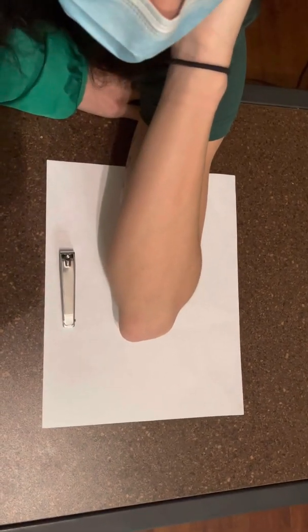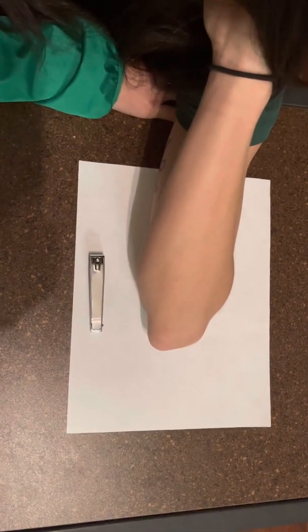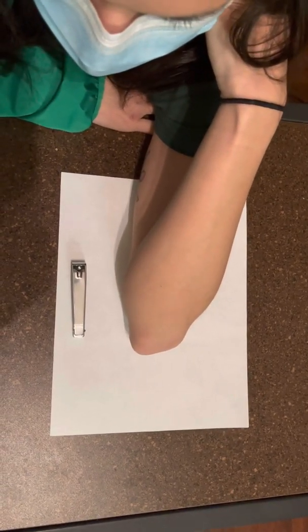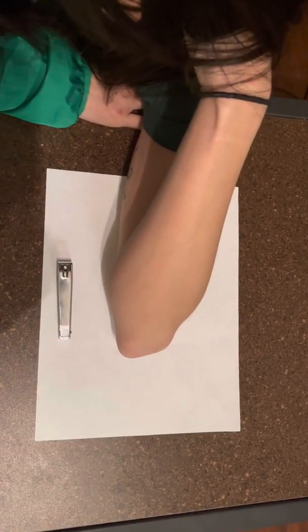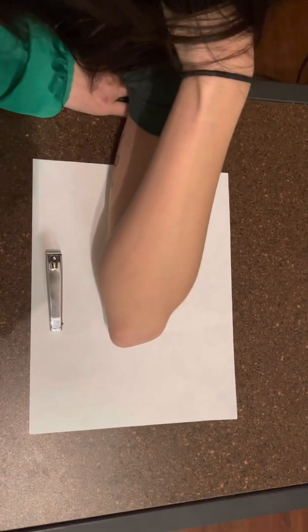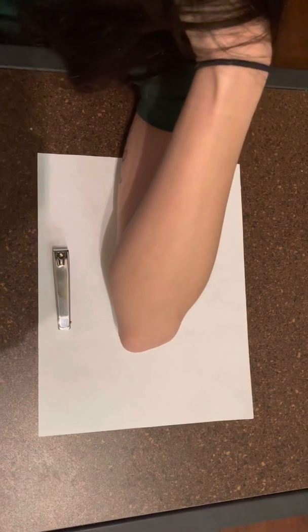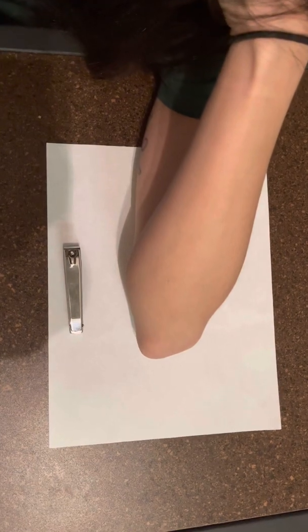For the elbow joints, the patient is seated with the elbow flexed and the fist resting on the shoulder. The central ray is directed perpendicular to the humerus, approximately 2 inches superior to the olecranon process, through the center of the receptor space. The anatomy demonstrated: the forearm and humerus should be superimposed with no rotation. The olecranon process and distal humerus should be visualized.